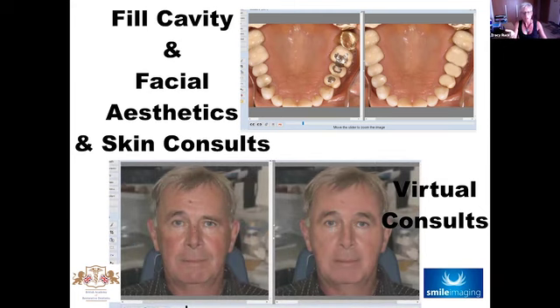And here you've got an eyebrow lift as well for this gentleman. For the eyebrow lift, we actually use the bridge and implant tool because that's a copy and flip tool, and that enables us to, anything we don't like on one side, if there's something okay on the other side, we can just flip that across and show them, and that's how we do the eyebrow lift as well. But we'll be looking at that a little bit later as well.